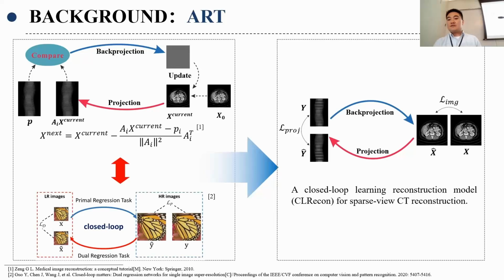In the sparse-view CT reconstruction task, iterative reconstruction algorithms can often provide better reconstruction quality than non-iterative algorithms. The iterative algorithm reconstructs the image by continuously forward projecting the reconstructed image, comparing the estimated projection with the measurement data, and then reconstructing the corresponding error image to update the target image.